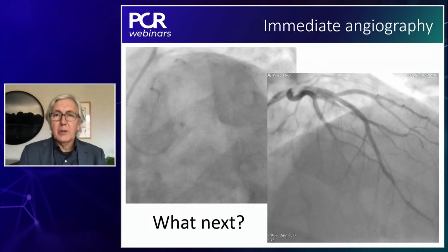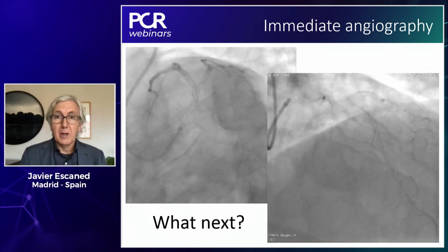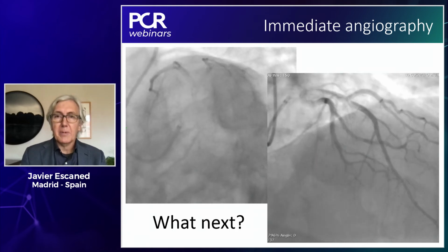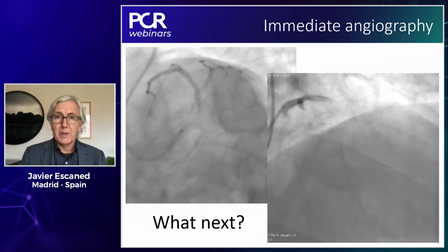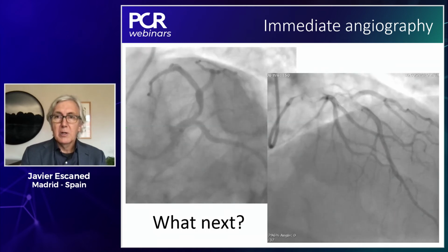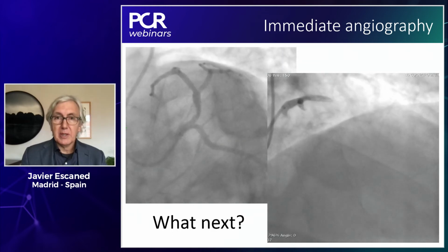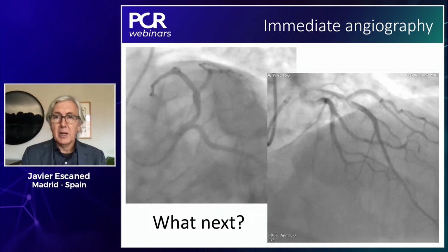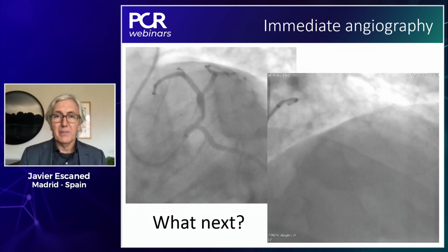Well, my suggestion, before we see what Tom did, is to keep an eye on this angiographic shadowgram that is telling us basically nothing about what happens there in this patient who had an acute coronary syndrome. We suspect that the damage must be very extensive because it has an apical thrombus. But apart from that, we lack any information as to the severity of the stenosis in the region of the left main, proximal LAD, and the substrate. So let's have a look at the clarifying effect of imaging.